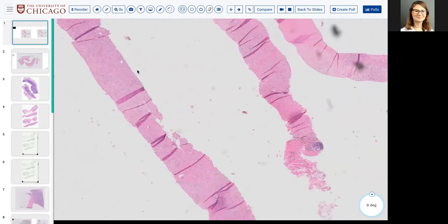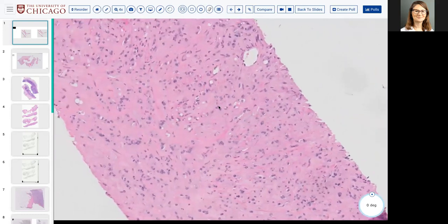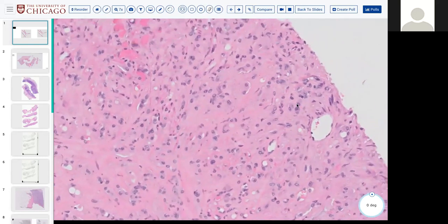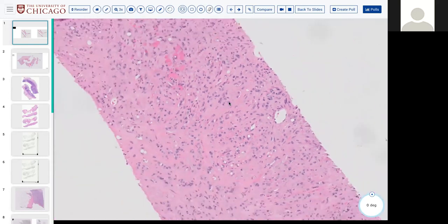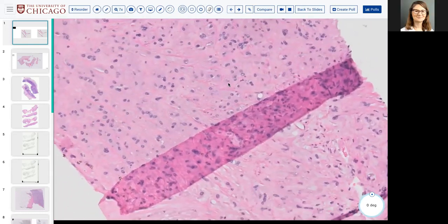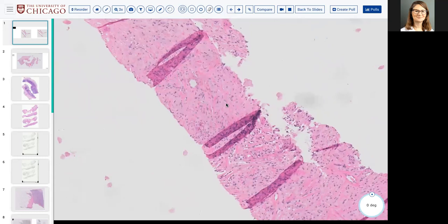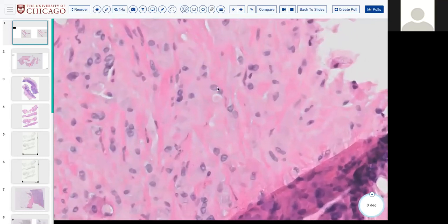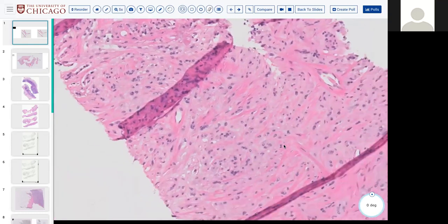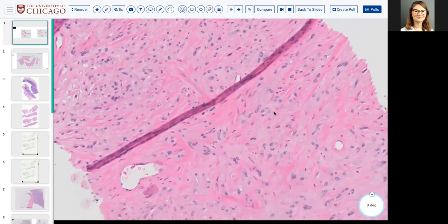Okay, awesome. So tell us what stains you might want to order and what a hemangioendothelioma is conceptually. Like vascular markers, I think like FLI1 maybe or CD34, or I don't know. Do you ever use GLUT1 in these examples? Maybe it's not very helpful, but why? Okay, all right, we can talk about all those, sure. And then when we're thinking about lobular, you could just throw a keratin marker. That would not be helpful. Okay, no, thank you. So we'll get into the stains and then we'll get into the biologic behavior.